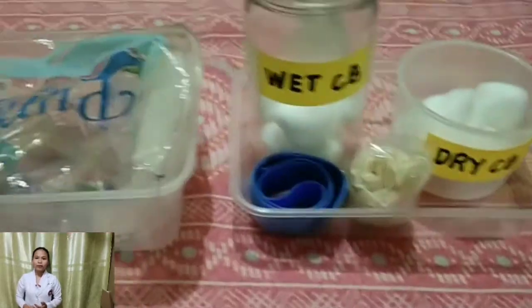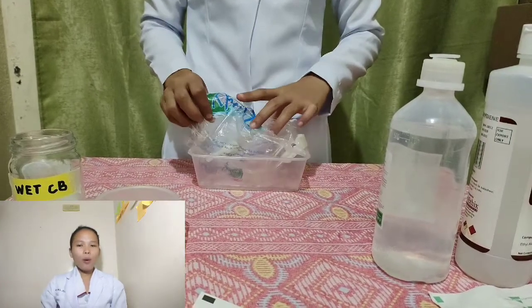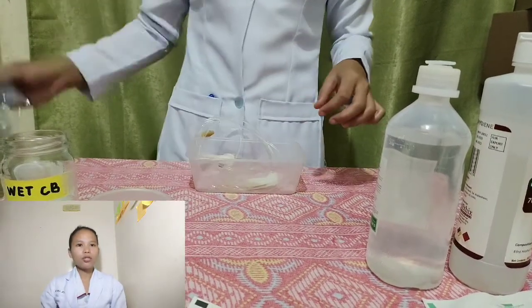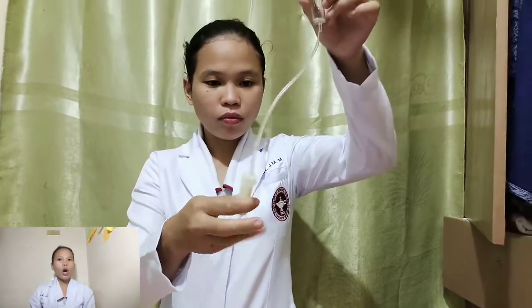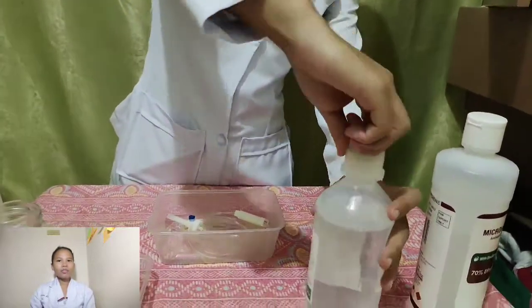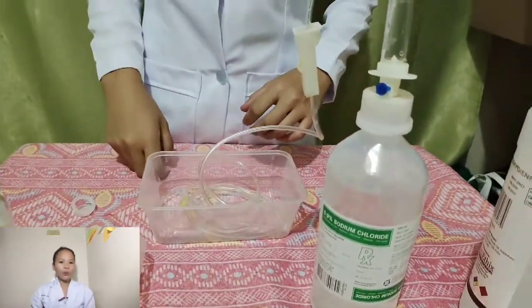Gather all the equipment and prepare the IV solution and IV tubing to have all equipment available and to save time and effort. Maintain aseptic technique when opening sterile package and IV solution. Prevent the contamination of IV solution set, which can infect the client rapidly. Tubing, uncap the spike and insert into the entry site on the bag or bottle as the manufacturer directs. If an additive is ordered, incorporate it before inserting the spike into the entry site. This punctures the seal in the IV bag or bottle.